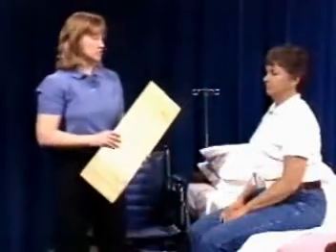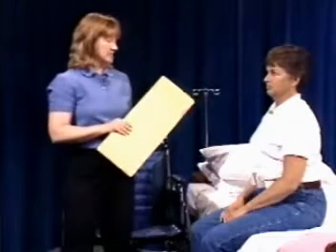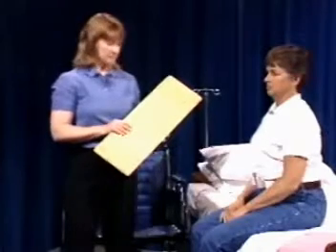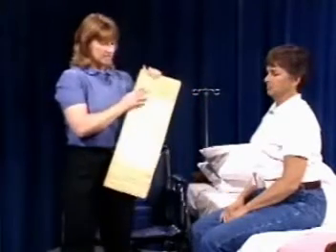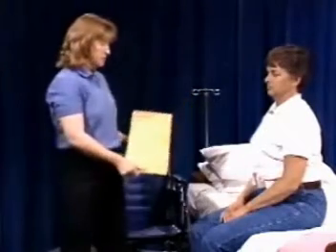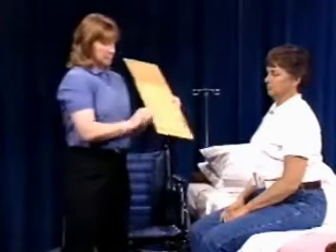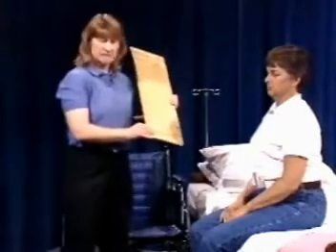The type of transfer I'd like to show you next is called a sliding board transfer. This transfer is used when the patient is unable to bear weight or when they are physically unable to get up on their feet for some reason. They do need to have good upper body control and fairly good upper arm strength. A sliding board is simply a piece of wood, or sometimes plastic, that's used to bridge the gap between two surfaces that you're transferring between. This sliding board is tapered on the ends to make the transfer a little bit easier.